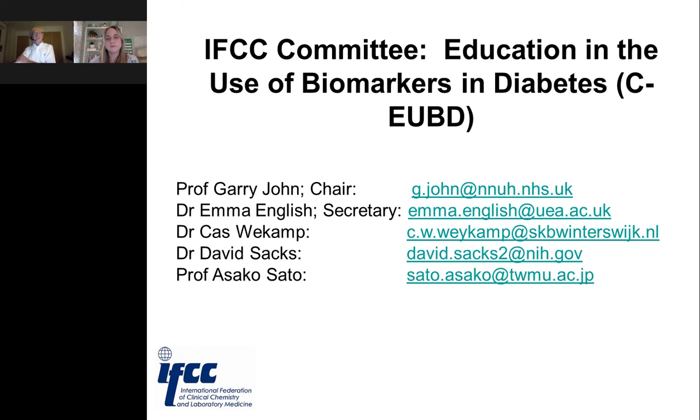I think here laboratories need to select the method they wish to use based on the quality of the method they've got, standardization of the method, and precision and accuracy of that method. Most manufactured methods that we have available to us now in the clinical laboratory are actually extremely good. But there are some methods out there which probably don't work as well as others. So you've got to decide for yourself in your particular laboratory what is right for you.